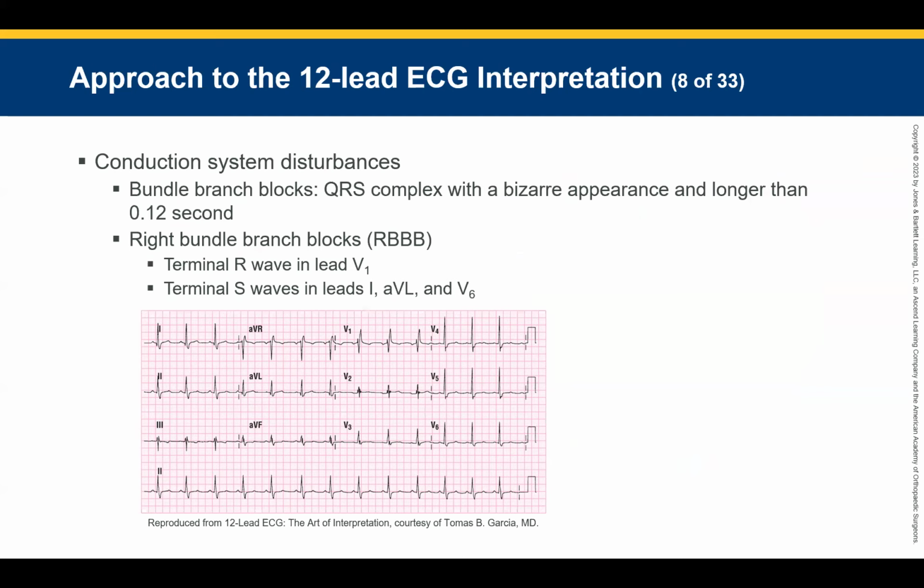The first thing we're gonna understand is bundle branch blocks. Of course, there's a lot of words up here, and we know we don't like words, so just ignore the words for a second. If you're up there looking at all those words, don't freak out. When we identify on a 12 lead what a bundle branch block is, we look at V1. We look at the QRS width in V1. V1 is where we measure QRS width on basically all 12 leads. So when we're measuring width, we're going to jump over to V1.